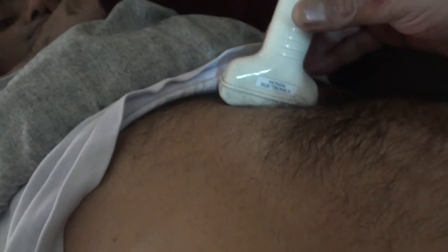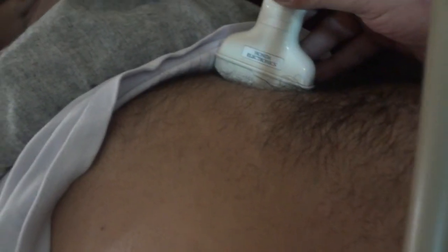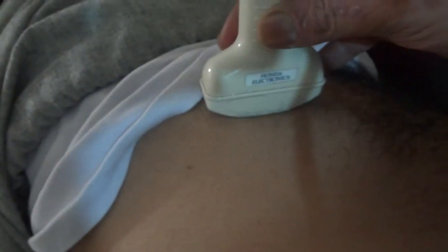All the angling is done here in the epigastric region. I place the probe longitudinally in the epigastric region and angle it over here, and this is mainly to see the portal vein, porta hepatis. Then we move the probe upwards in the intercostal space.